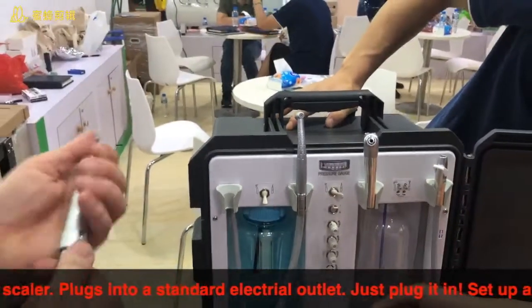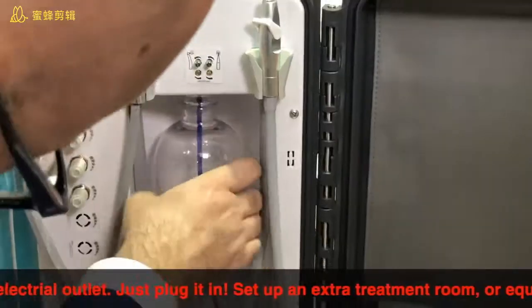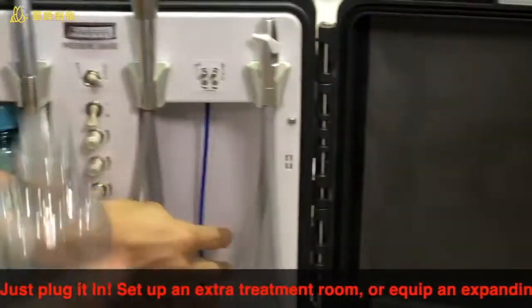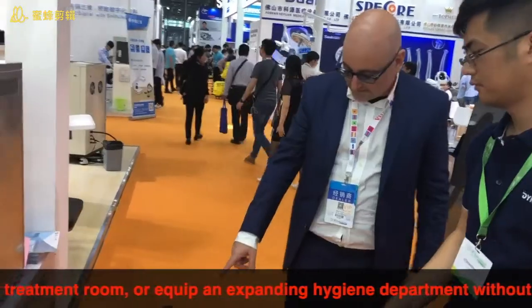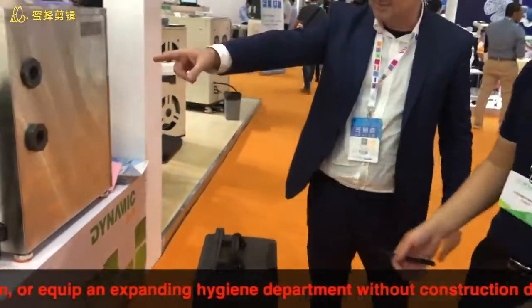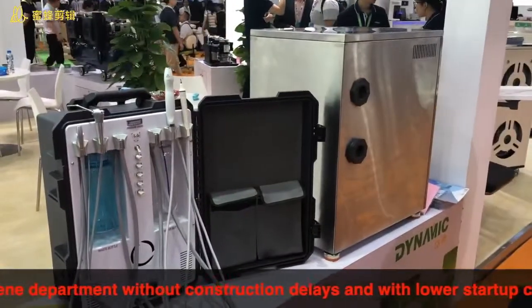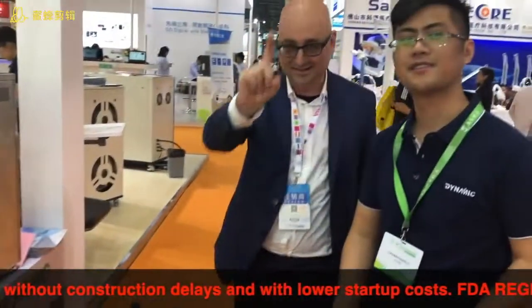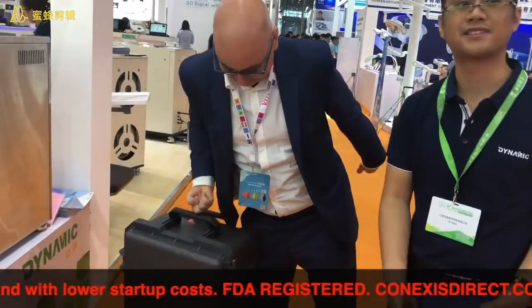Okay? And this is the low speed. So this is where you put the water in. Distilled water, okay? So here is the unit that's closed, and here is the unit that's open. And with one finger, I can lift it and put it back down.